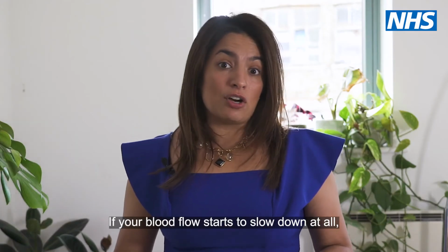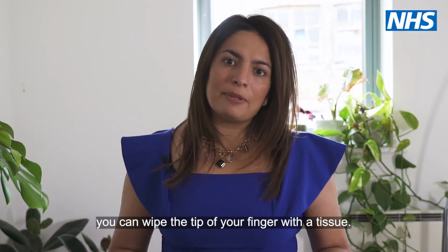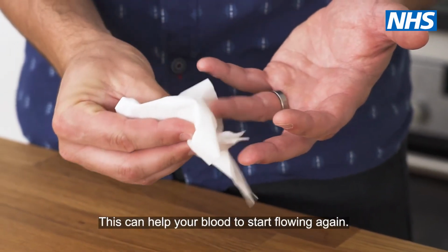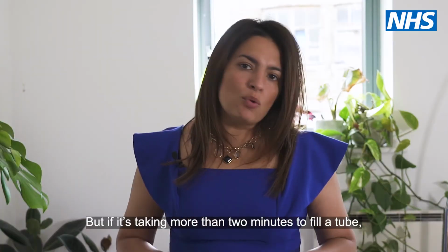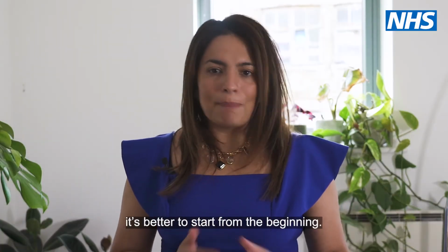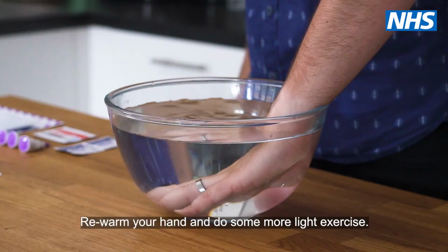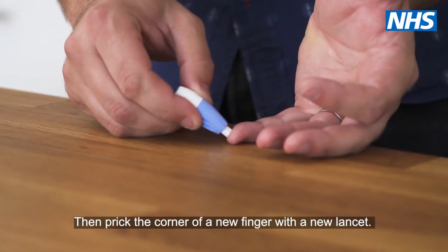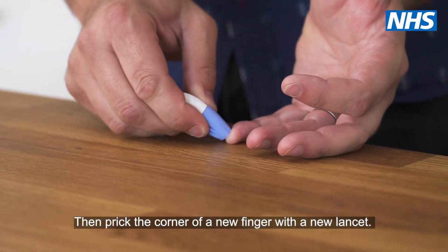If your blood flow starts to slow down at all, you can wipe the tip of your finger with a tissue. This can help your blood to start flowing again. But if it's taking more than 2 minutes to fill a tube, it's better to start from the beginning. Rewarm your hand and do some more light exercise. Then prick the corner of a new finger with a new lancet.